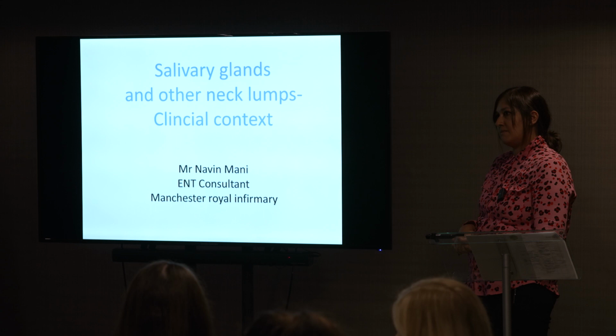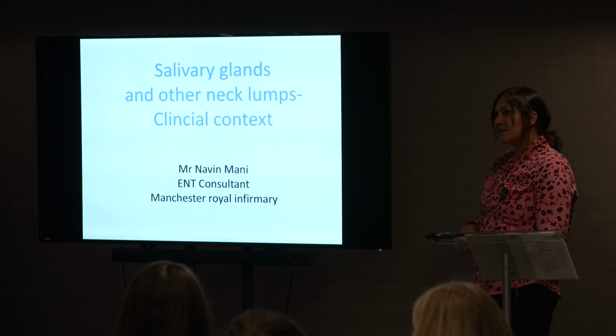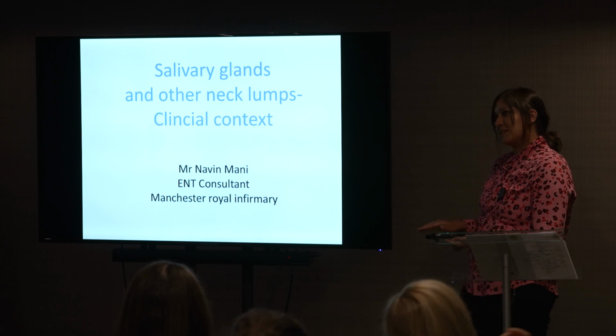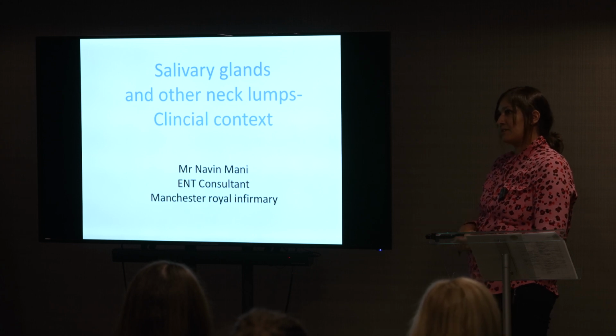And then my second question was, do you always go for FNA first, or would there be any cases where you do a core first? How do you decide between the two? So if I saw something that looked like obviously lymphoma, I think that's the only thing that's recommended, that you get a core biopsy before FNA, histological diagnosis.